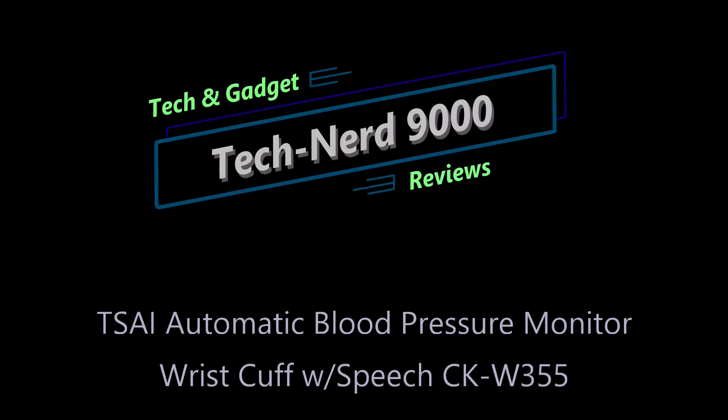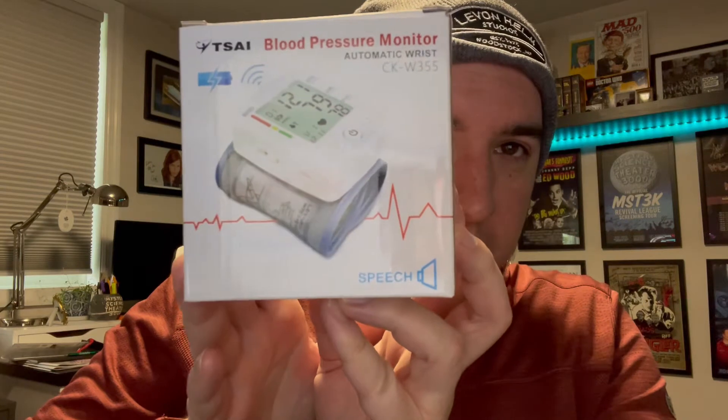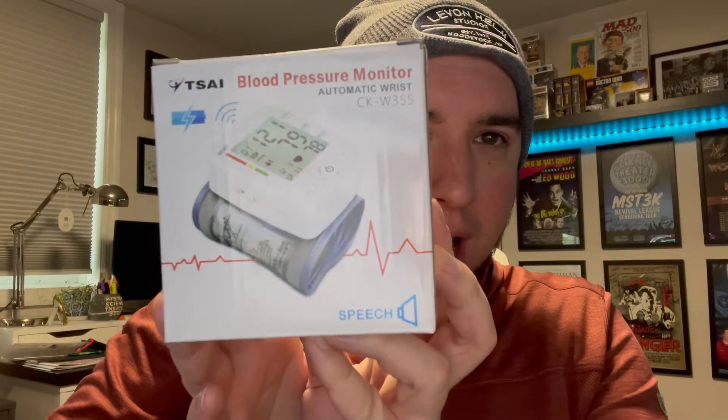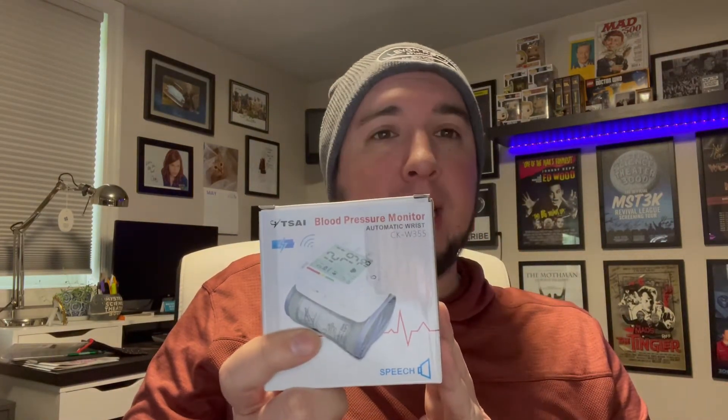Folks, this is what we're working with: the TSAI blood pressure monitor automatic wrist cuff. This is a wrist cuff that gives you your blood pressure. There's a little speaker here — I think that means it talks to you, and that's a little alluring. Remember when you'd go to the grocery store and sit down in the big machine to take your blood pressure? How, in 2021, is this small little thing going to work? I don't know — we'll see.